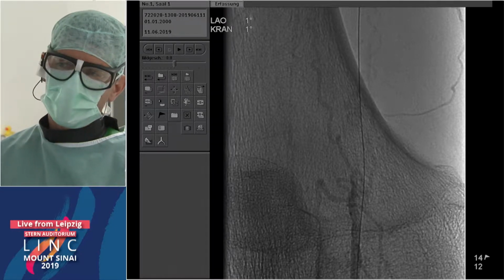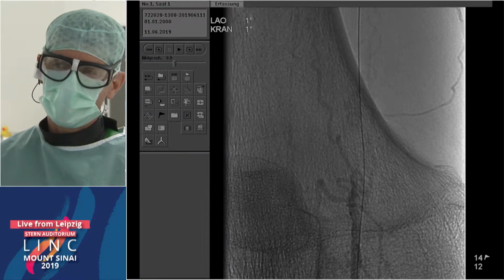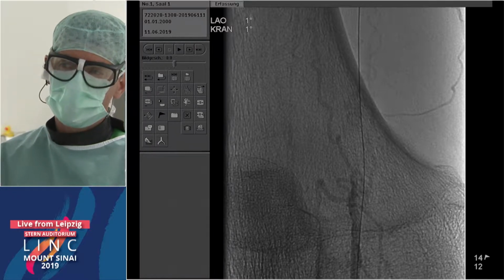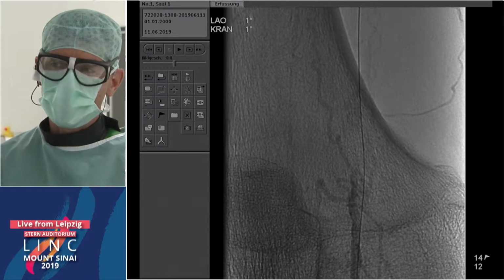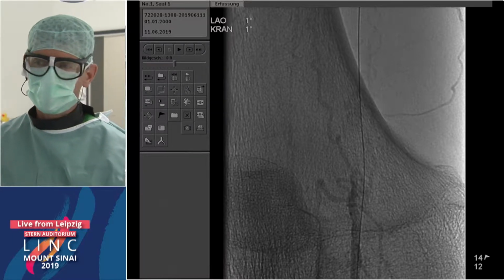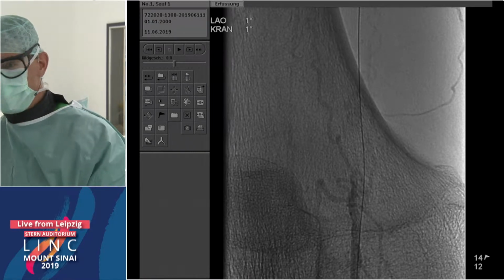So, I don't know. If I would plan to do atherectomy, maybe I would try to redirect the wire, maybe go retrograde and try to somehow take the wire into the true lumen. On the other hand, there's obviously very often no way through the calcium, but just around, and that's also what happened here. So what do you think? Would you be happy with this or restart here?